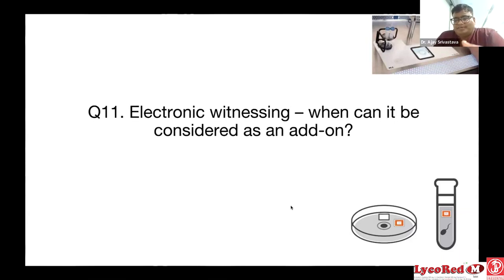Sometimes the net doesn't come, sometimes there are network issues, the barcode cannot be accessed, and then everything gets mixed up. Horrible. I don't think it is good for the lab. They say if you have to add something to the lab for a lab show, then okay, we have an electronic witnessing system. What happens is, in the starting when you are preparing the barcode, if you enter something wrong over there, the whole process will go wrong.